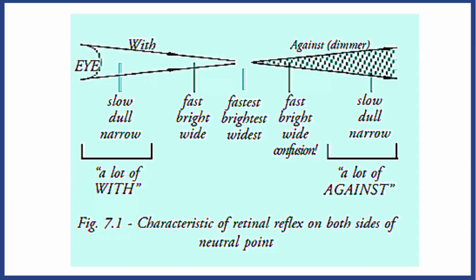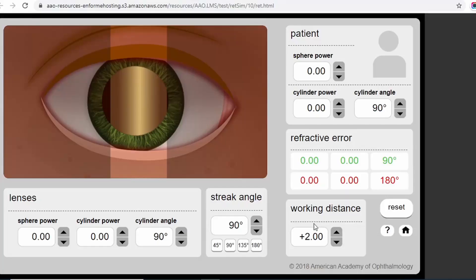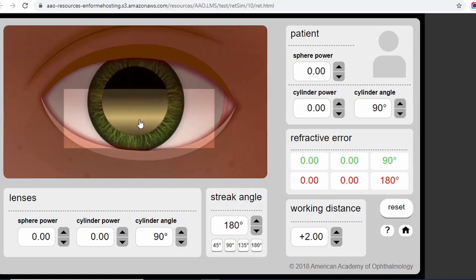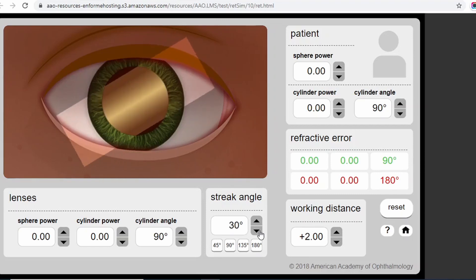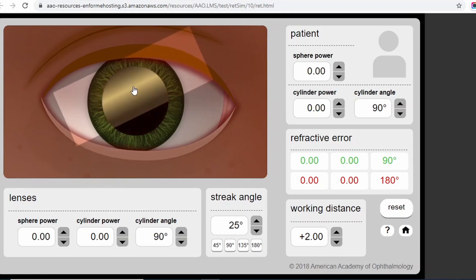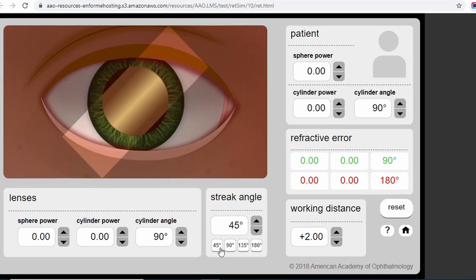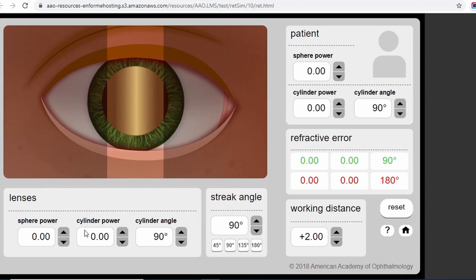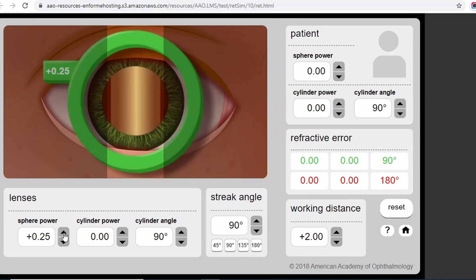Always observe whether the movement is with or against, whether the reflex is moving fast or slow, and whether it is dim or bright. In the case of an emmetropic patient who has no refractive power, if you are at your working distance and perform retinoscopy, you will see with movement. You can rotate the streak to different angles — at 180 degrees or at 45 degrees — to observe with movement. Once you neutralize an emmetropic patient, you need to add your working distance lenses on the trial frame.